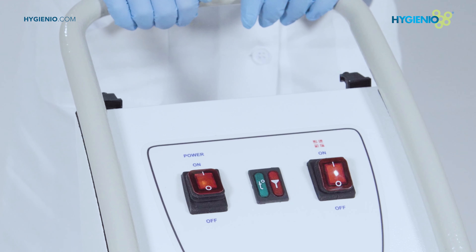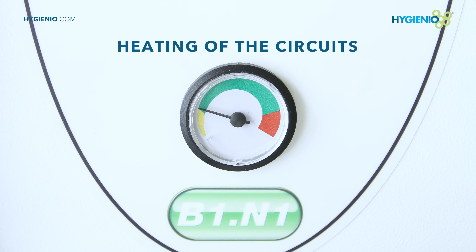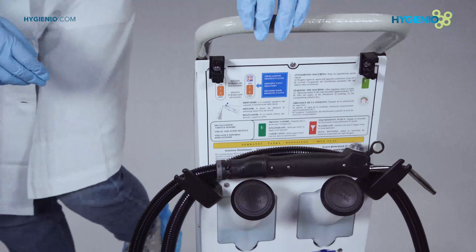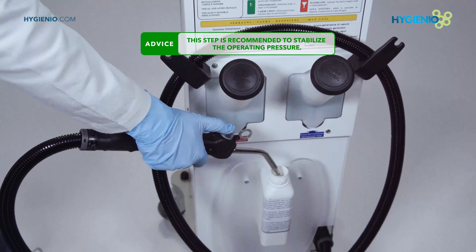When the hand of the pressure gauge is at the limit of the yellow section, about six to eight minutes, an initial drain of about three to five seconds into the condensation collection container is recommended.